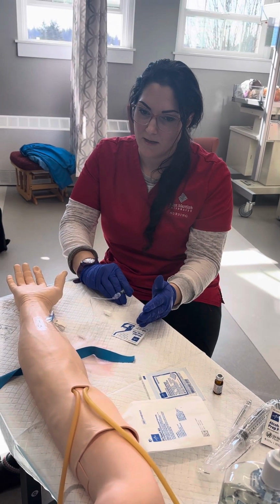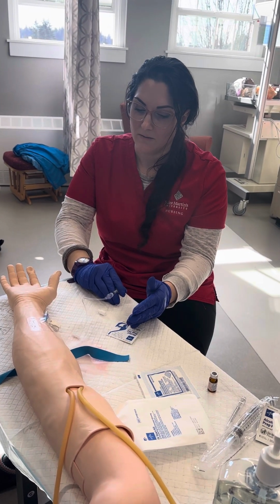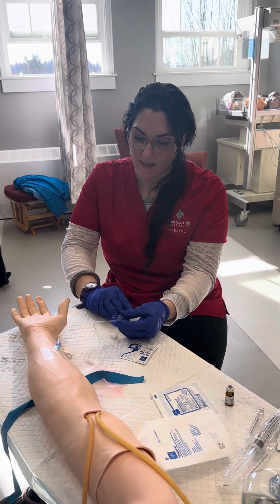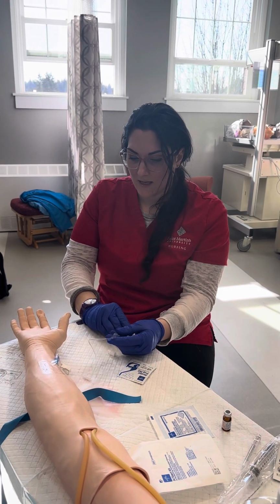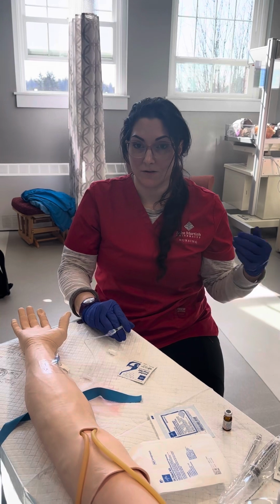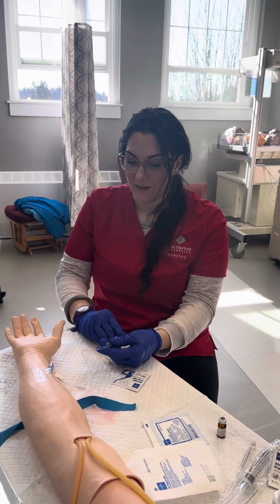And I would also let him know that he has his call light, and to let me know if he needs help or if he's experiencing any symptoms. And I would assess his IV site and all that fun stuff. So I'm administering this over 3 minutes. I'm kind of pushing fast for time's sake.